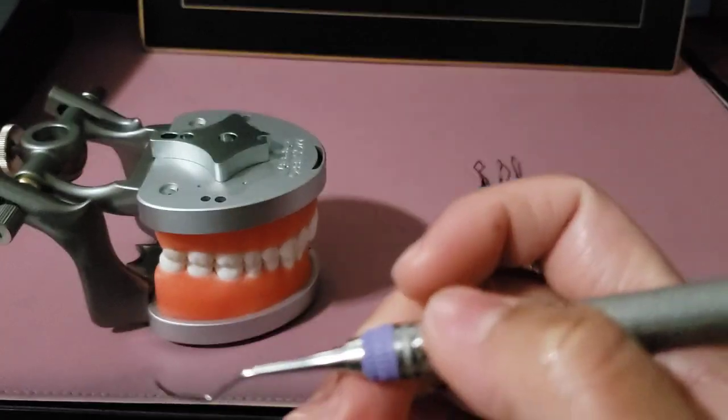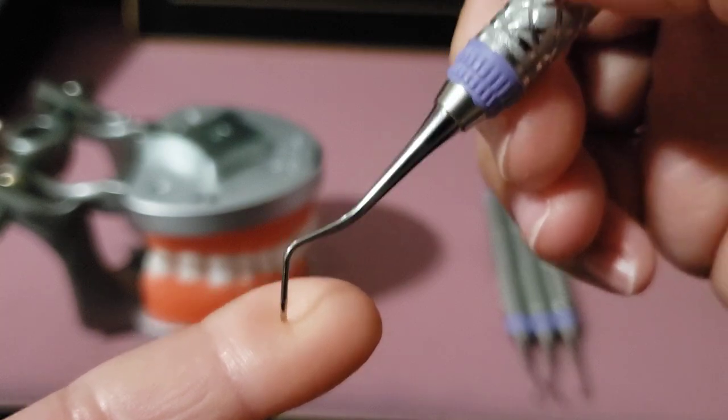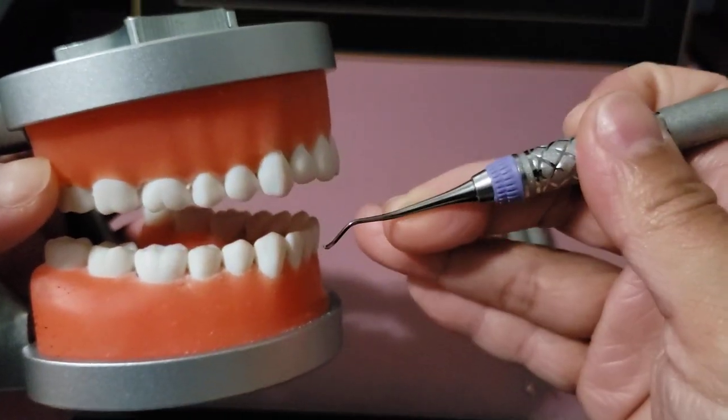For the universal curette, the face of the blade is always at a 90-degree angle to the terminal shank. Both sides of the blade are activated, and it can be used on all surfaces of posterior and anterior teeth.